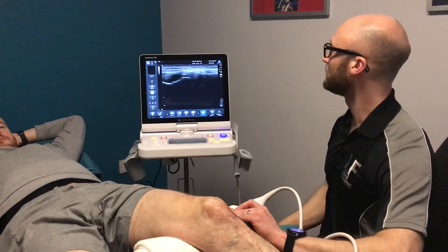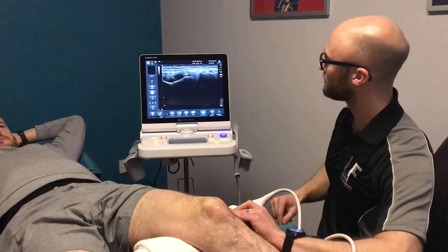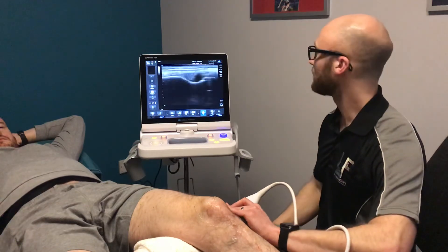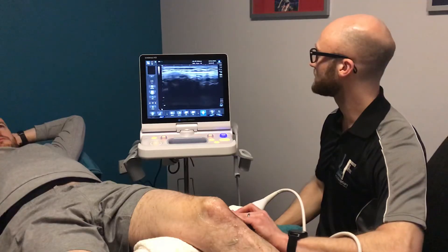On the outside of the knee, again we can look at the knee joint line with the structure known as the lateral meniscus, and we can see another tendon called the popliteal tendon, and also overlying that we can pick up the lateral collateral ligament as well.